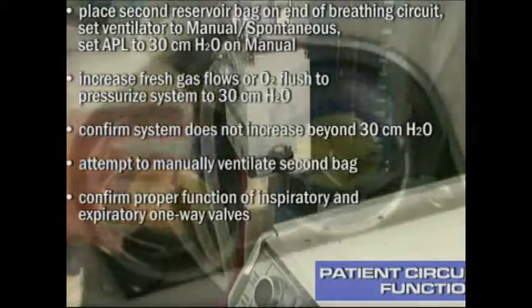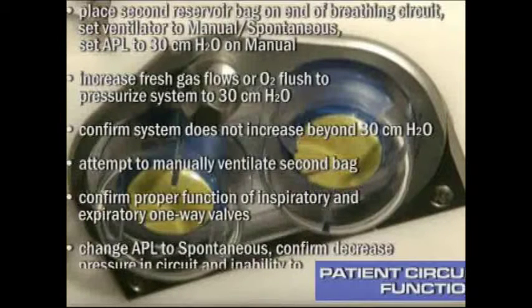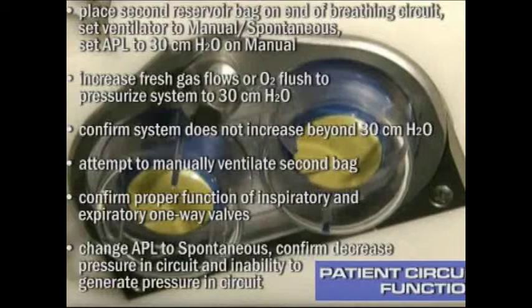Confirm proper function of inspiratory and expiratory one-way valves. Change APL to spontaneous. Confirm decreased pressure in circuit and inability to generate pressure in circuit.